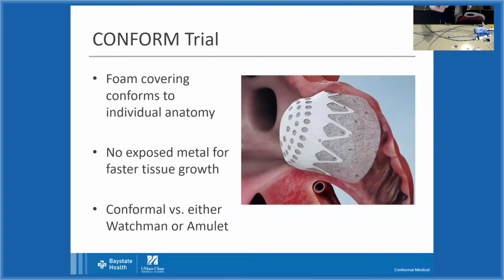This device, when you put it in a left atrial appendage, assumes the shape and size of the left atrial appendage. So this device is designed to fit everybody's anatomy differently and uniquely. Now, this device is not commercially available. It is currently part of a clinical trial that we're participating in, and it's comparing this device to either the Amulet device or the Watchman device. Okay, so that's ongoing.